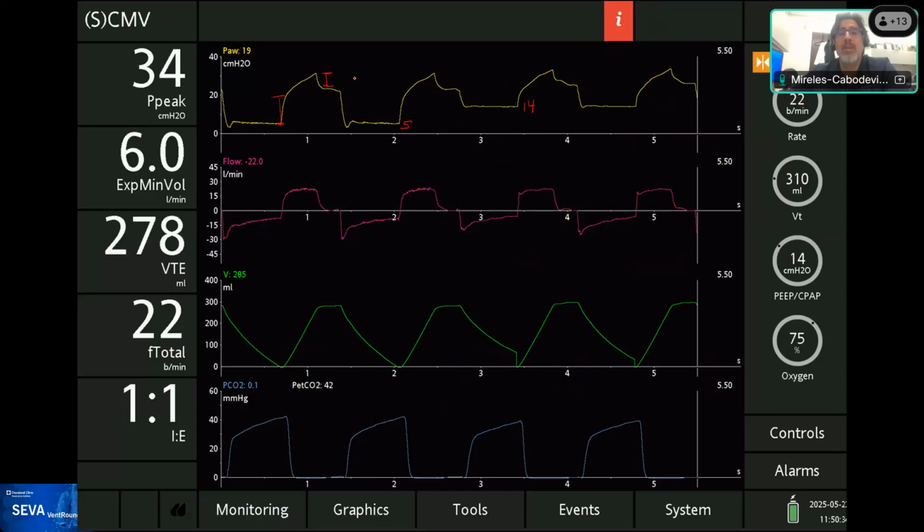From here to here, you can see the step up has become the same size for both breaths. You see that? The parallelogram resolved from being this big chunk of distance over here to now being the same height. Any comments on why that happened?